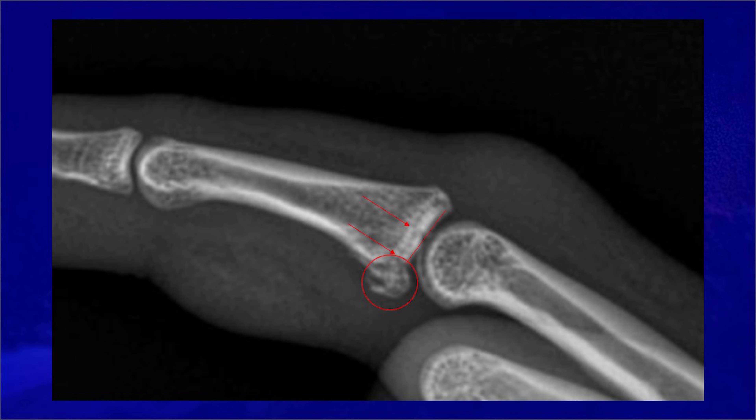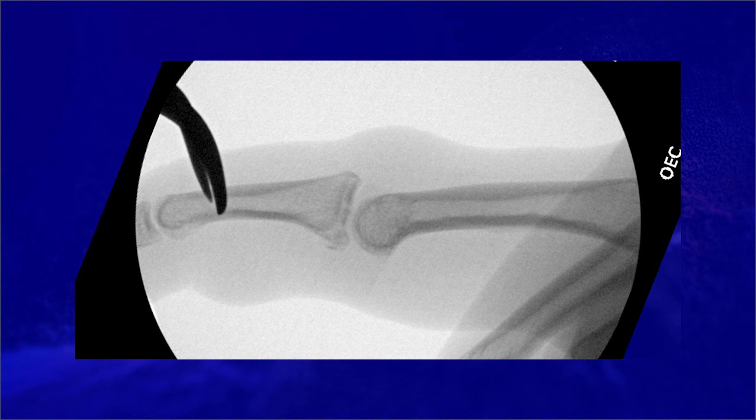There's also a volar avulsion fracture from the volar plate, and if taken in isolation, would clearly only require buddy taping. You can consider treating this with only a dorsal extension block splint, but my concern would be the impaction of the joint and complete loss of the concavity of the joint, which would lead to a suboptimal result. This intraoperative floor shot shows the impaction and the significant volar instability.